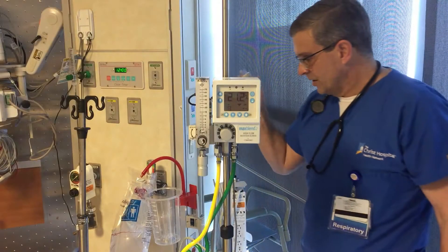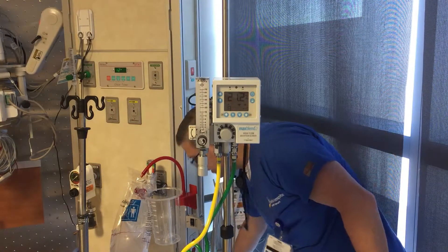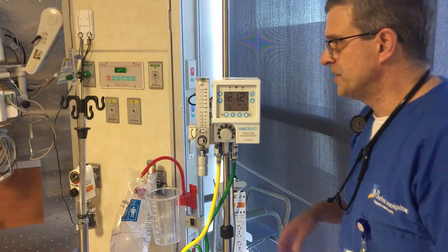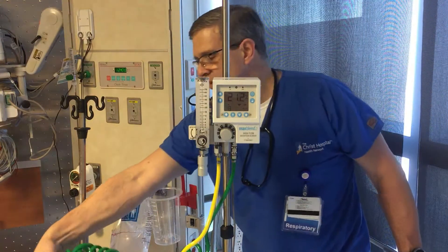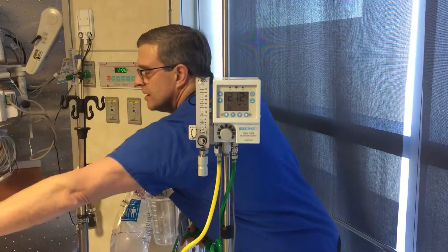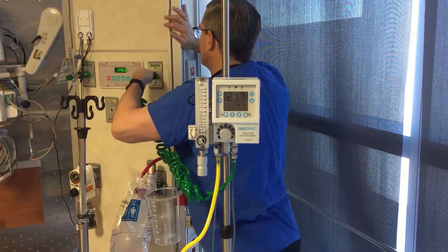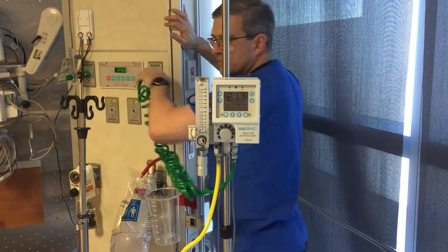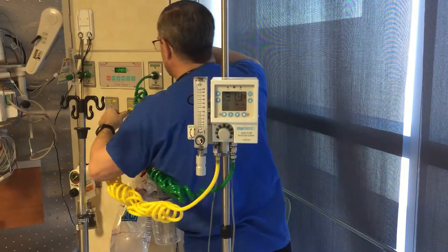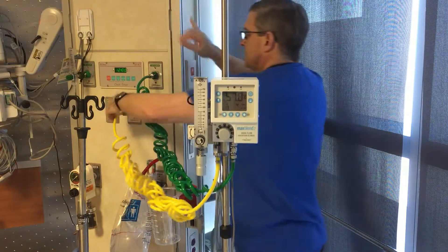To set this up, we're going to plug it in. You want to plug it into a red plug so that in case the power goes out, it will run off the backup generator. And we're going to plug our oxygen 50 PSI line in. That's just the blender.